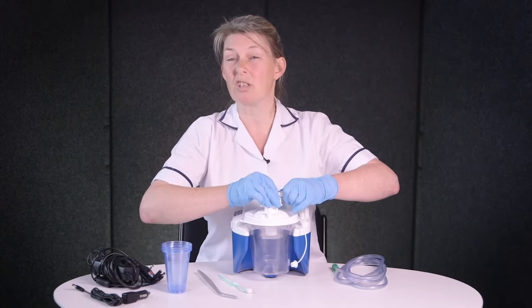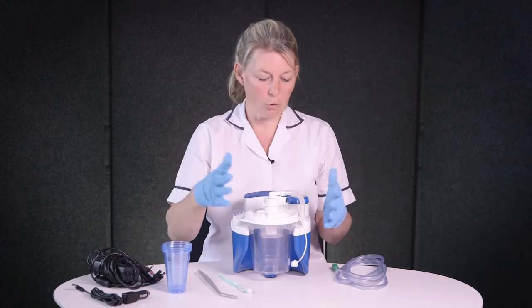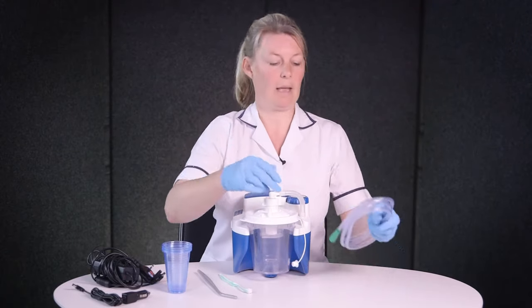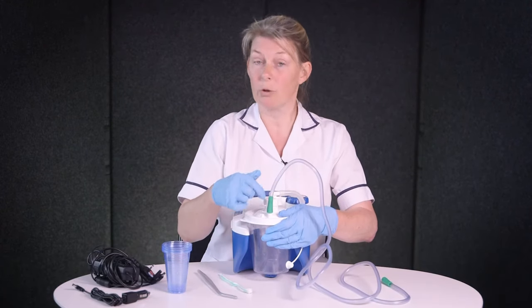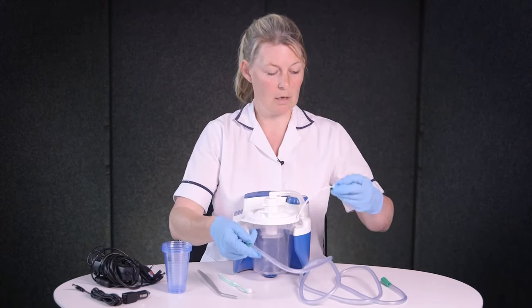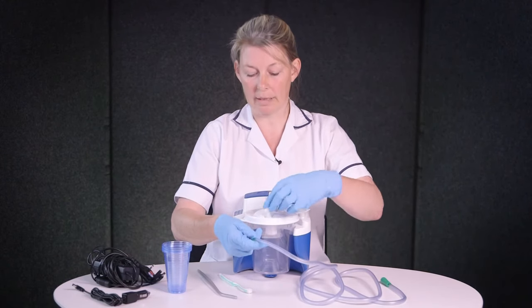It's important to consider if you want to wear gloves, face protection, or a pinny. Then we're just going to get the long tubing and attach it — it says 'to the patient' if you're wondering where to go. If you are carrying the canister you can actually put a little lid on top to make sure that the secretions are secure in the canister.